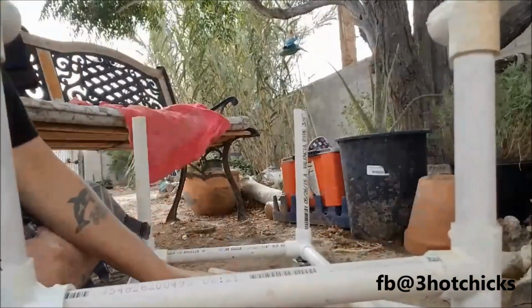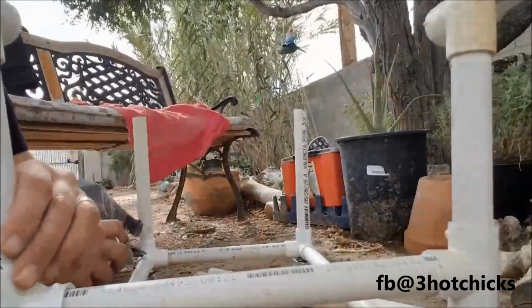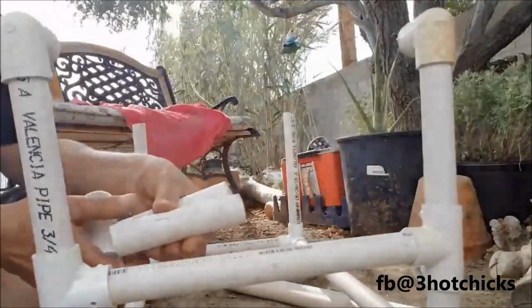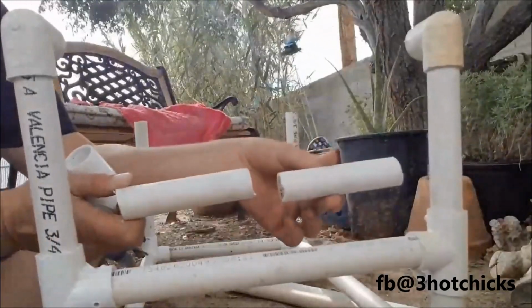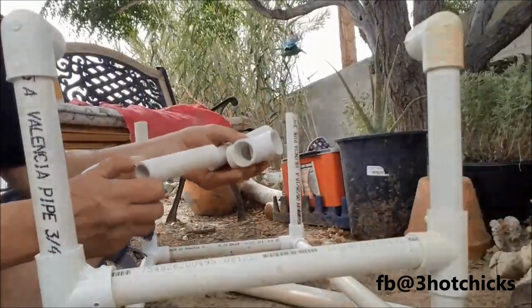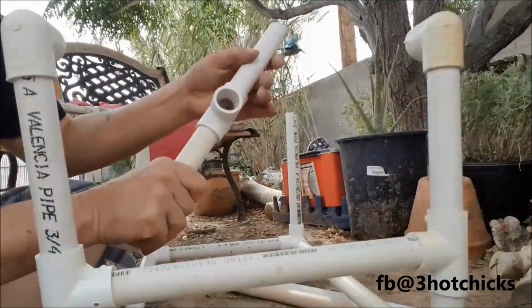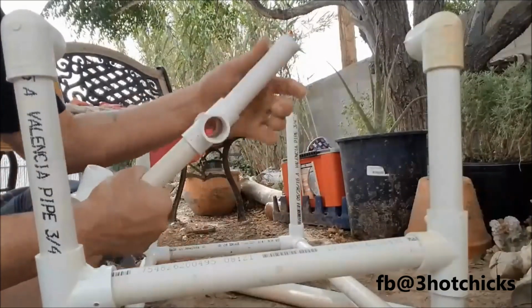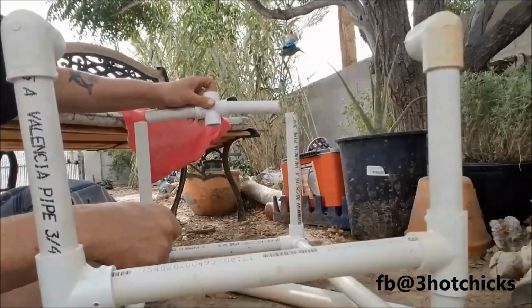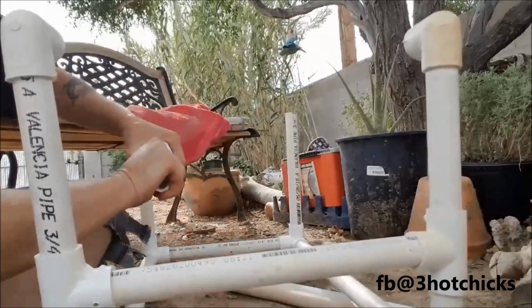And then on the back, what we did is we used three-way fittings, and instead of having the bar straight across like this, we cut the bar in half. We cut this in half like this, and you can add a T fitting. I've got a four-way fitting, but you can add a three-way fitting. And what we did is we attached a piece of PVC onto this top part here, so you could push the wheelchair, and then that way you don't have to bend over. And I'll show you when it's done how it worked out.